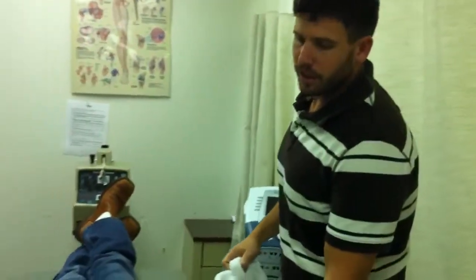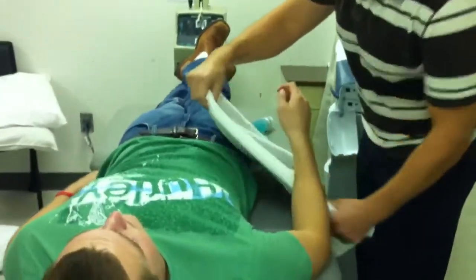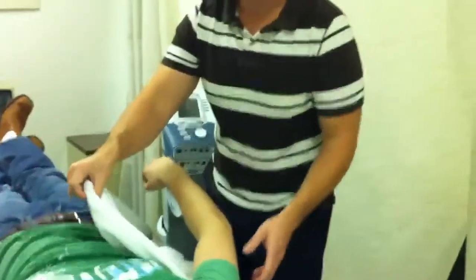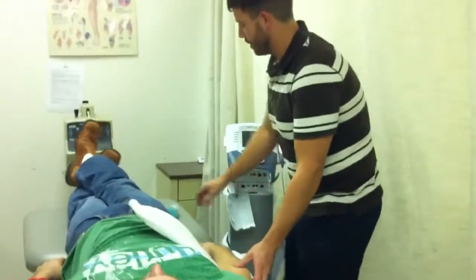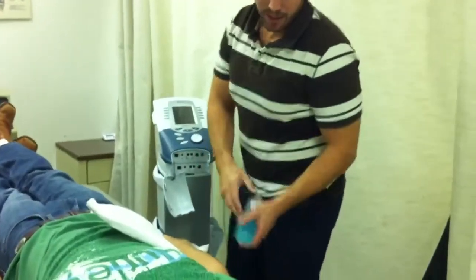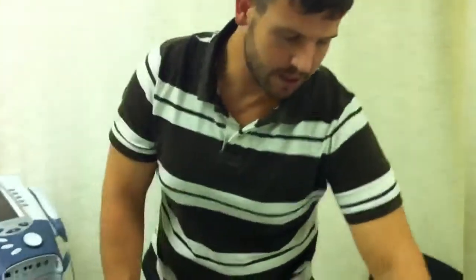We've just finished up some stretching exercises for the lateral epicondylitis. We're going to go into ultrasound treatment. That's why he's in this position — normally you wouldn't necessarily have to have him in this position, but it's whatever patient comfort requires. We're going to get everything set up and make sure you don't get any gel on any of their clothes, because the gel is pretty sticky.